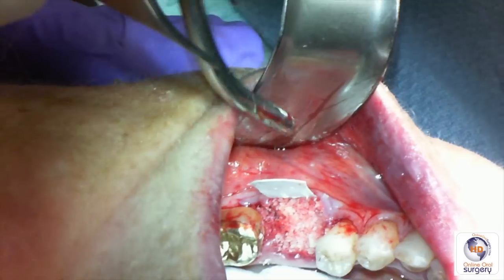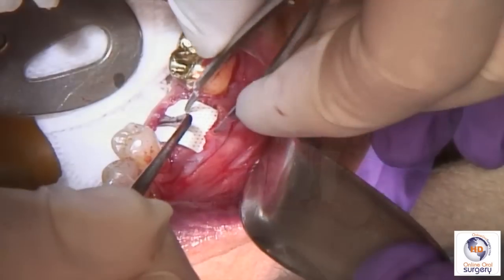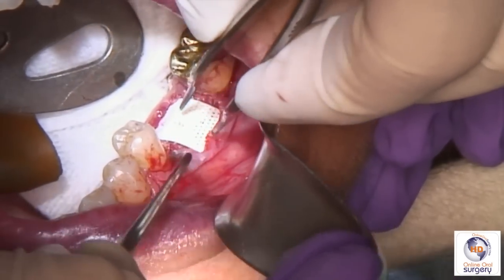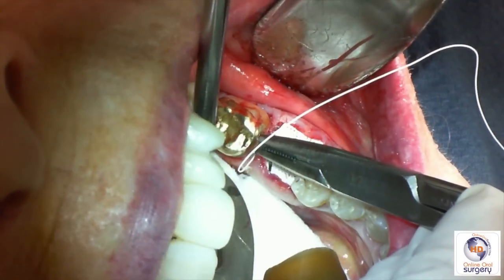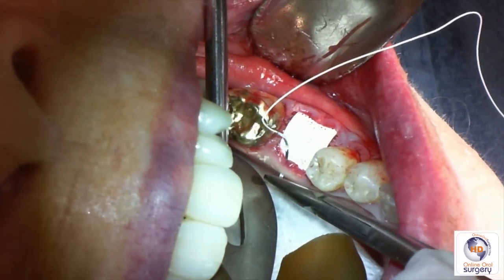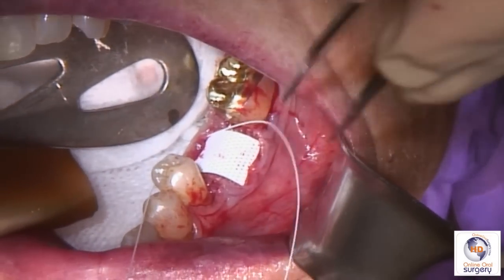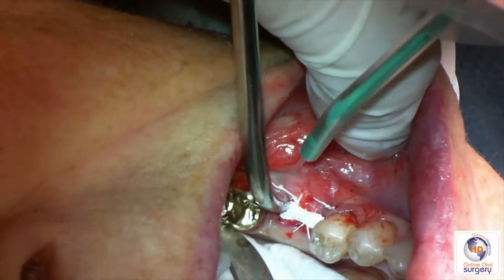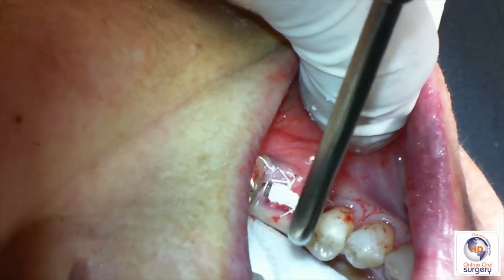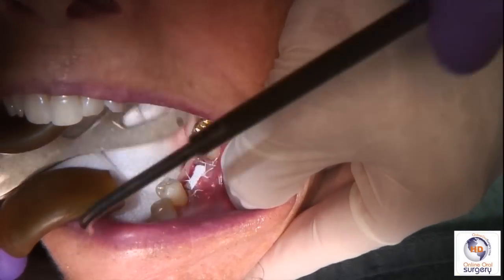Once we've completely filled the extraction socket with bone, we're going to take our membrane and tuck it in on the lingual into that pocket we developed. Remember, when handling the membrane, we want to use a non-toothed adze and forcep. So we put the lingual part of the membrane into that pocket, and then we suture using the cytoplast suture. By elevating our flaps, we're actually bringing the attached mucosa just a little bit more coronally. We irrigate well, and you can see that we've got the membrane nicely tucked underneath the flap of tissue on the buccal.